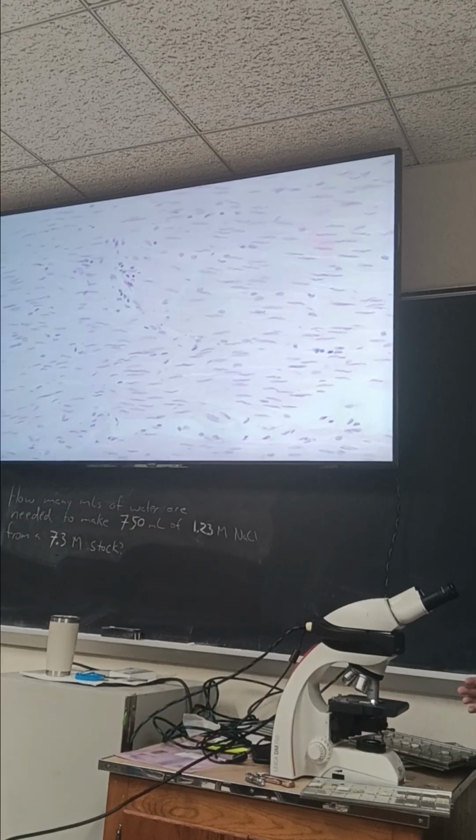What type of tissue? What do you think? Help me narrow it down.